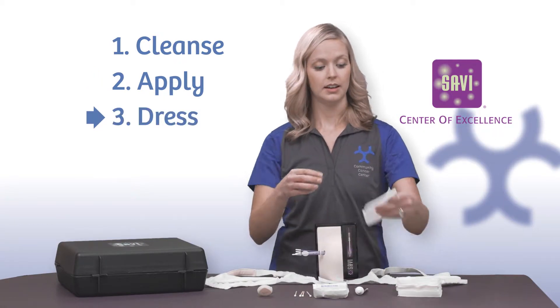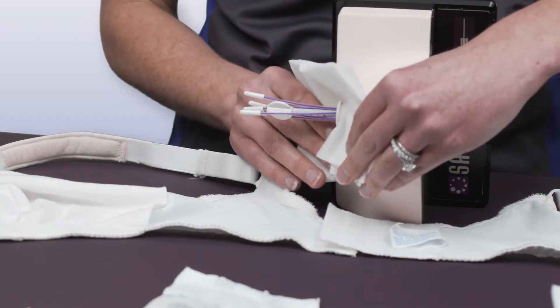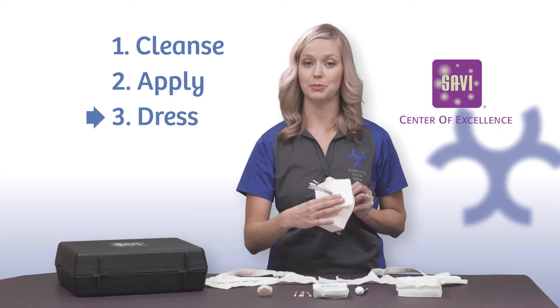Dress. Take a gauze pad in an alligator mouth type fashion and put it on the area surrounding the site. You'll want to ensure that you go underneath the white hub, as this will allow extra protection.